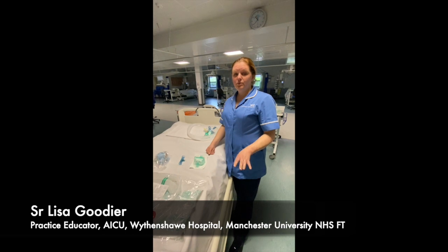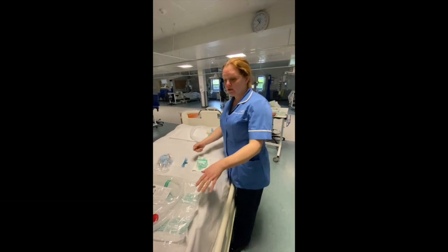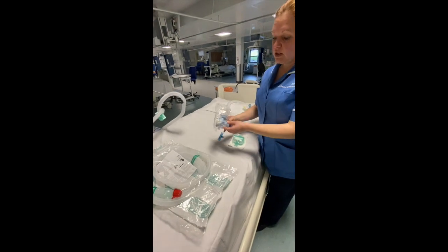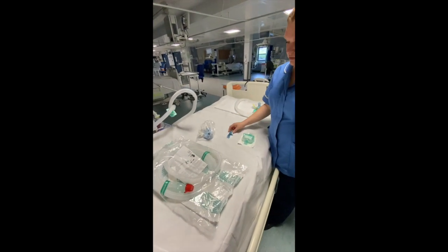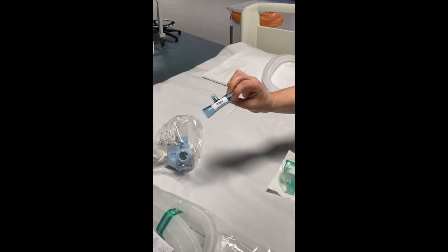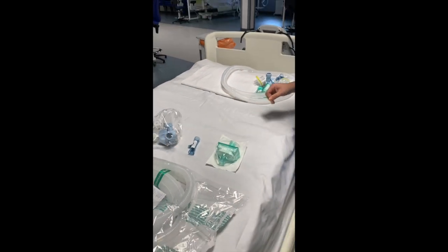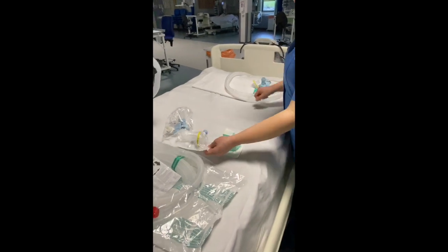The equipment you need for setting up the Draeger V500: you'll need the hoses, tubing, an expiratory valve, an expiratory flow sensor, an HME filter, and a bacterial filter, which is one of those.